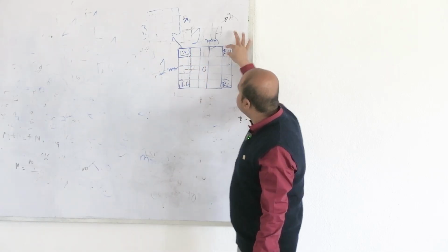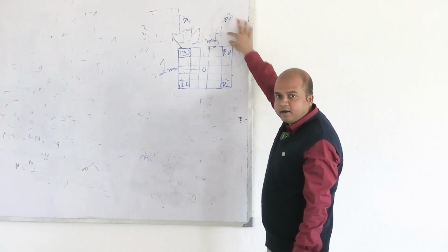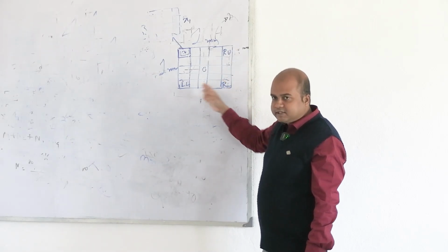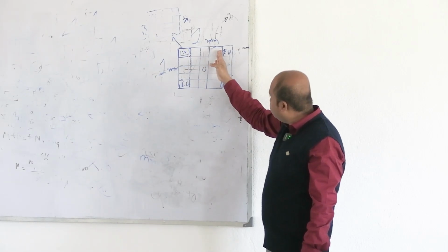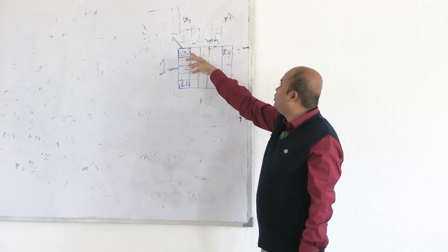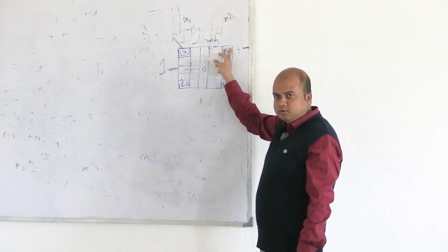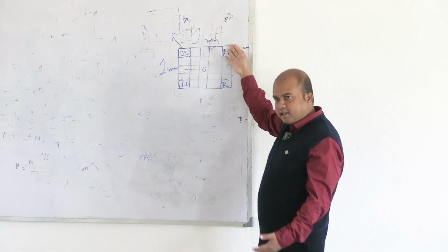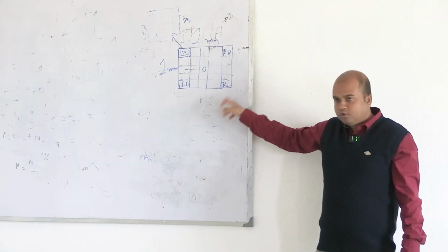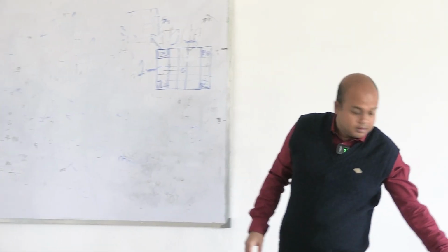Then we move 3 cells, we get the right upper one, and we confirm it by the triple lines over here on the right and upper side. Then come down, after counting we come down, and it is similar. We confirm by going 3 cells, actually 4, that means leaving 3 similar cells. If we go to the next one, that 4th cell is the another corner, but we will confirm it by seeing the triple lines on these 2 sides. Again here also. So, by this method we identify the cells and complete our counting, and then the calculation part.